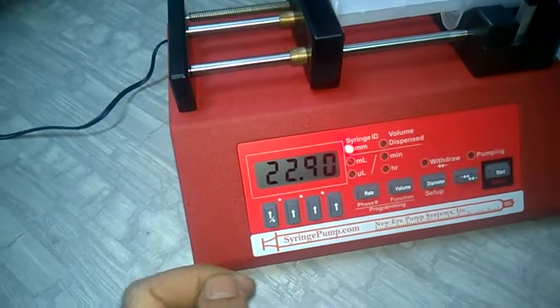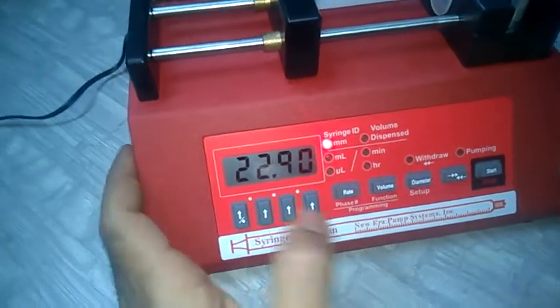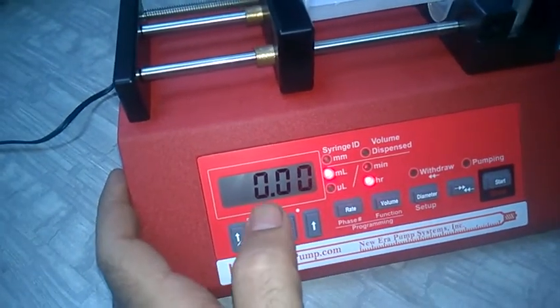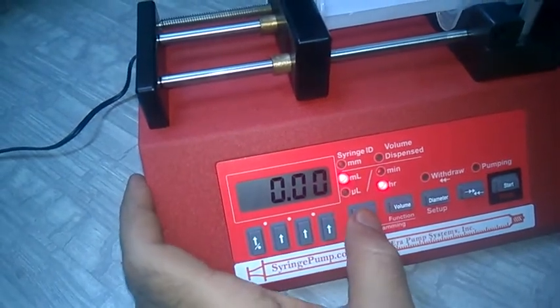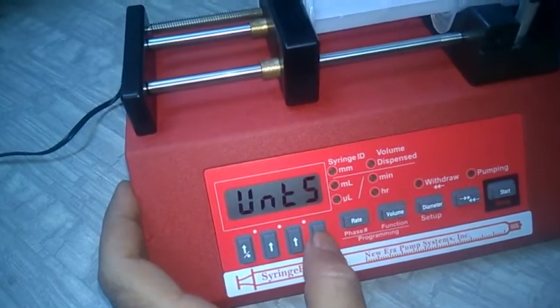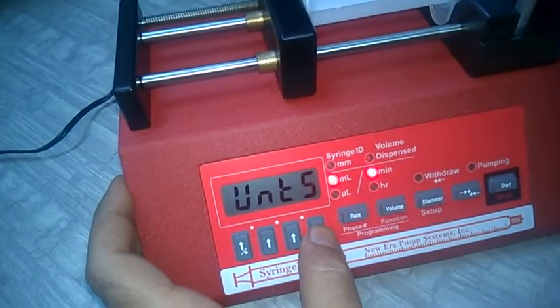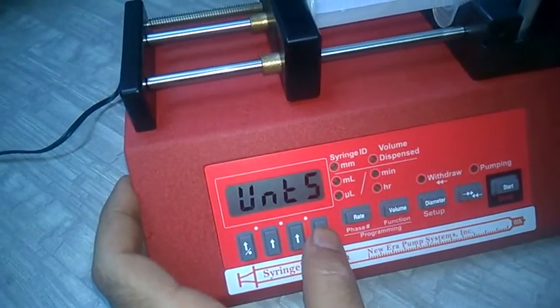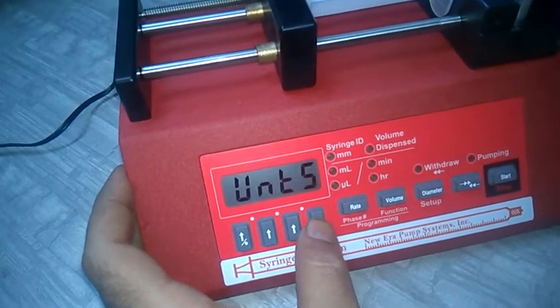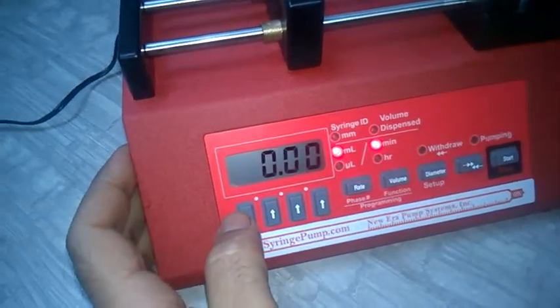Now suppose we want to set a rate of 2 ml per minute. Press the rate key. The default unit is ml per hour. Press it again and you will see two LEDs flashing. Press it again and use the arrow keys to cycle through the units: ml per hour, µL per hour, µL per minute, ml per minute. Select ml per minute and leave it there.